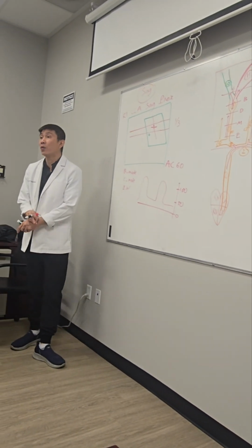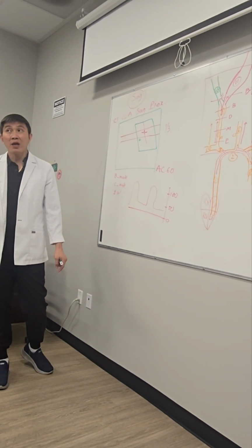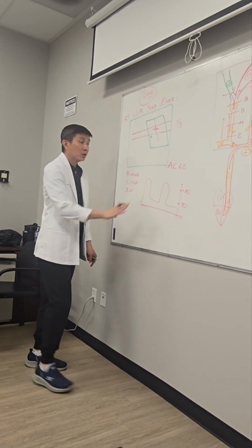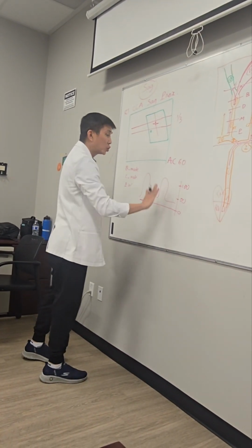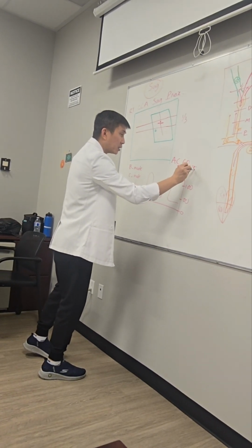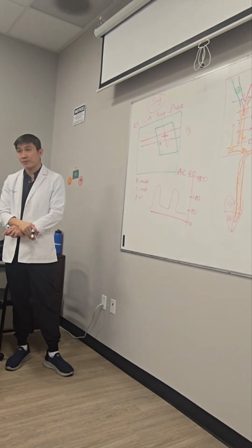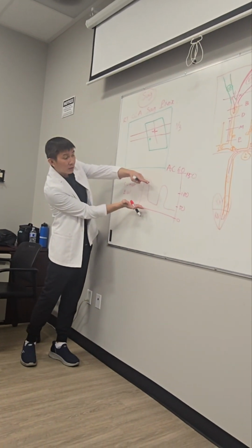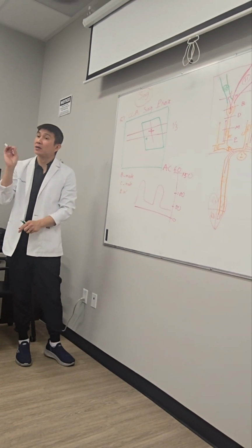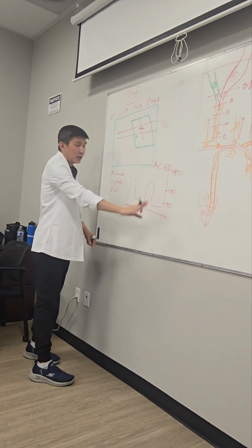And right here you're gonna see the numbers. This is the scale. You can adjust the scale to eliminate the aliasing. So I want you to adjust the scale to get this waveform to 2/3 of the scale. It's going to be 150, for example. So this is going to be the good waveform. This distance is 2/3 of this distance by adjusting the scale. And then you collect enough signal right here.